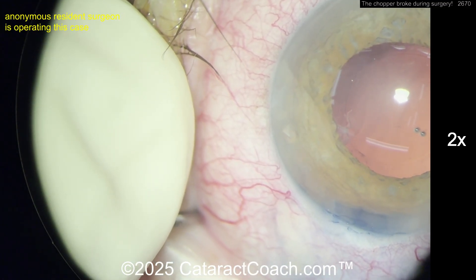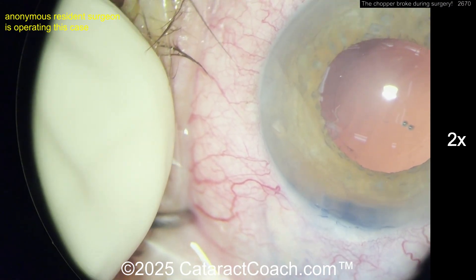Those capsulorrhexis forceps go through the incision. This again shows you the importance of good draping — you wouldn't have to have your finger there if you had good draping.